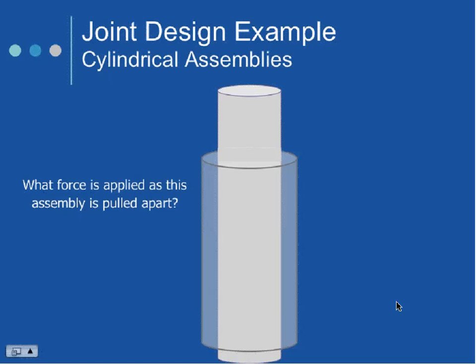Another thing that we've seen in needle bonding, if you're not familiar with it, is to put annular rings or bumps around the inside diameter of the hub material. And that gives you more of a mechanical bond. It doesn't really increase your adhesion, it just gives it more resistance to pull for the plug.